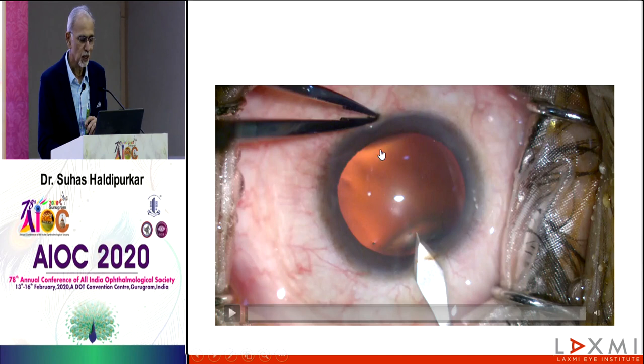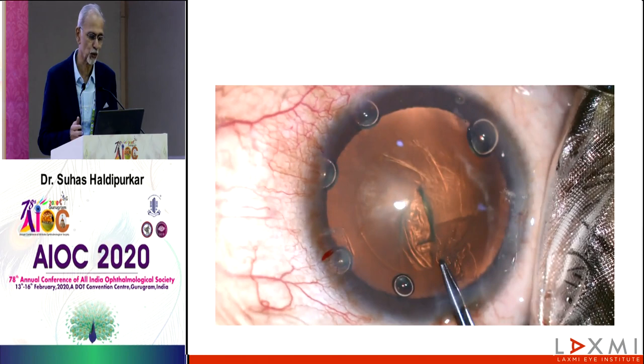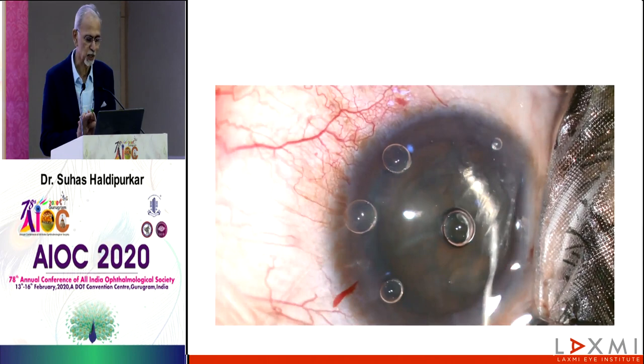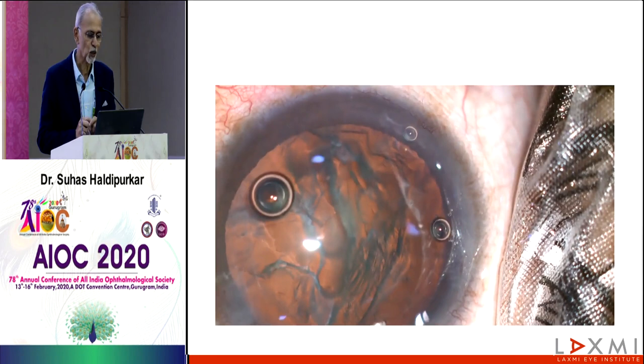You have to be attentive, and luckily on that day I was attentive, and I'm sure most of you would always be. Now it's a normal case. A normally done hydrodissection, I start with the case and watch it. Now, I had a PCR. Why did I have it? That's because my settings were not okay. But then I was watchful.